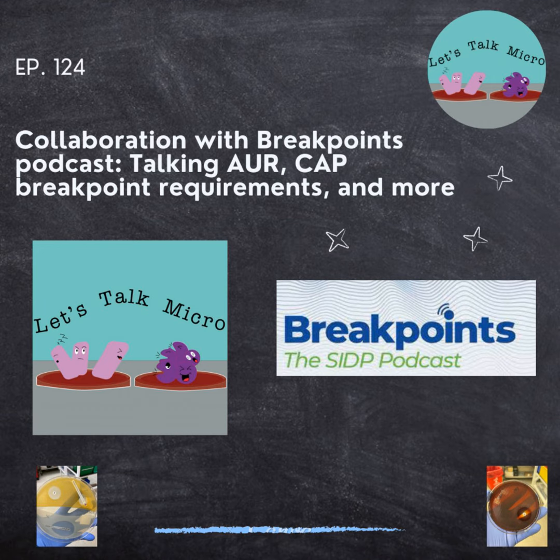Now, it's important for the laboratory to emphasize that if we don't have this update, this will be negatively impacting the accreditation of the laboratory. So the decision has to be made to be able to adjust and adapt to this new breakpoint and allow the laboratory to perform the validation process.